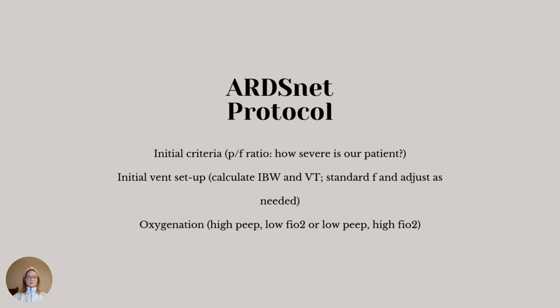As far as setting up our frequency, we're going to give them a standard frequency that meets a baseline minute ventilation, and we're going to adjust it as needed. For oxygenation, we could do high PEEP and low FiO2, or we could do low PEEP with a high FiO2.